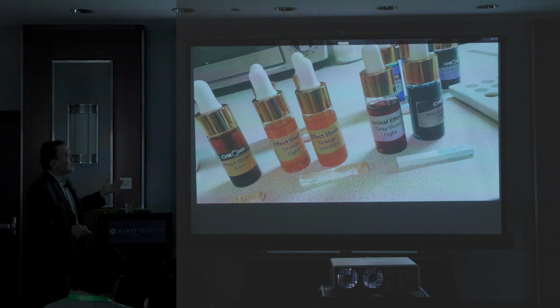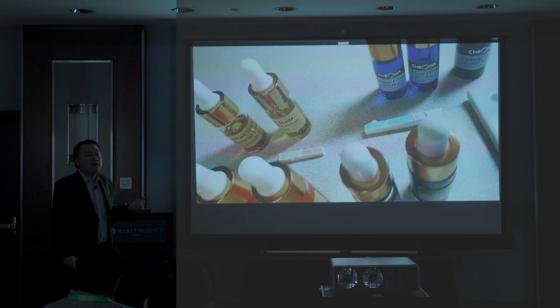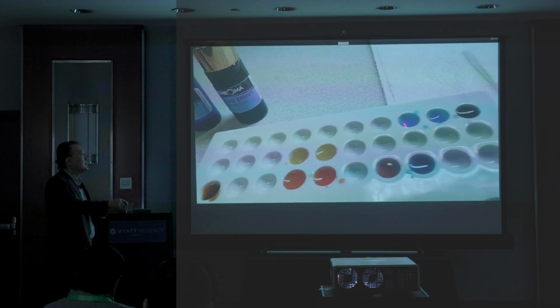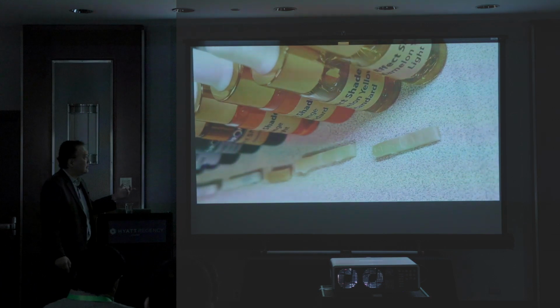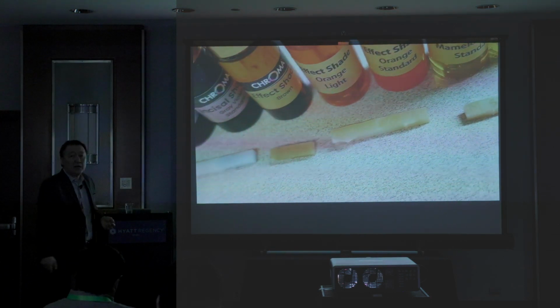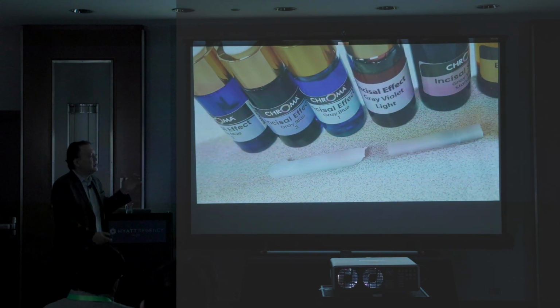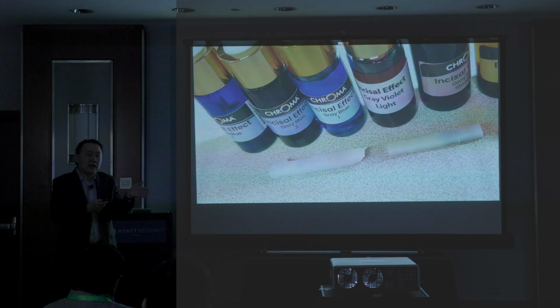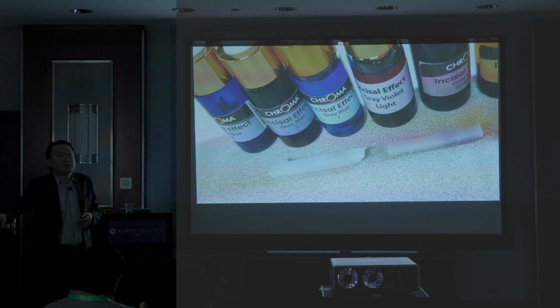They have an effect kit which I tested quite a bit. They have pretty good stuff. But there is a little bit of really good information here. I just test it and then fire it, which is the center. Then I can get some of the color. I really don't recommend this kind of thing because whenever you're using a small sample, you don't see the final color. So that's kind of uncertainty.